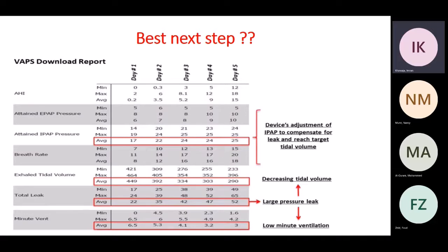So how do we know how much leak should be acceptable for every patient? Let me explain this to you. The intentional leak is the leak from the mask that should normally escape your mask. The unintentional leak is the one we need to keep to a minimum, which kind of seeps around because of abnormal facial anatomy, the mask being too large, too small.